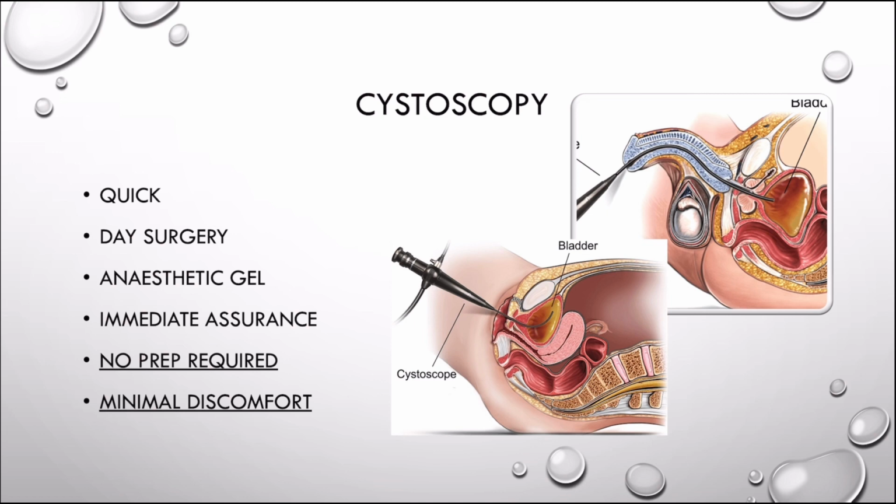For cystoscopy, it's a very simple, straightforward procedure that has no need for any preparations. It's also minimal discomfort. On the picture on your left, we show a cystoscopy done in a female anatomy, and usually a gel is all you need. On the other picture, it's one of a male urethra that is being cannulated. We look into it. The whole process takes around 3 to 5 minutes, and you can be reassured immediately if there is nothing found.